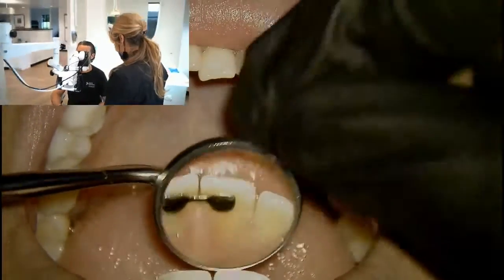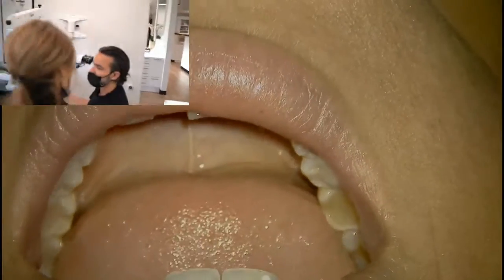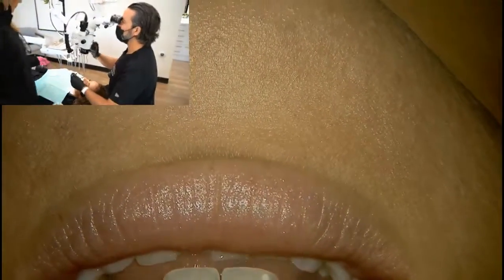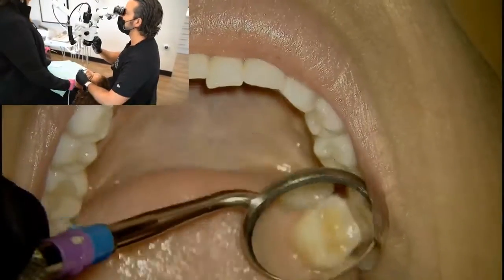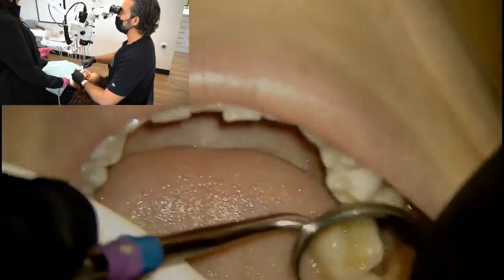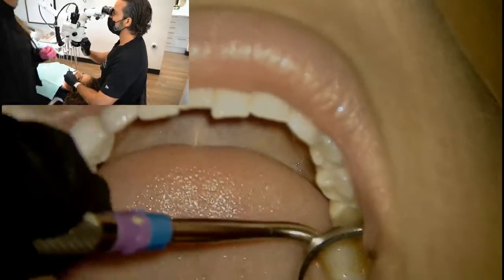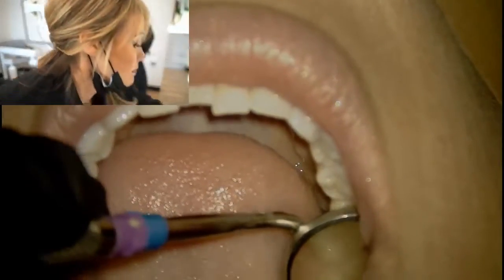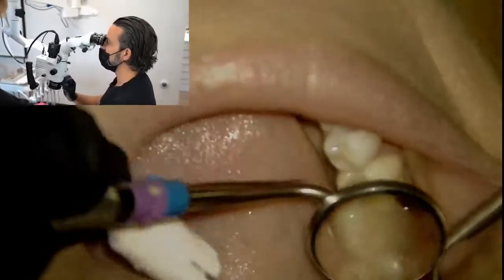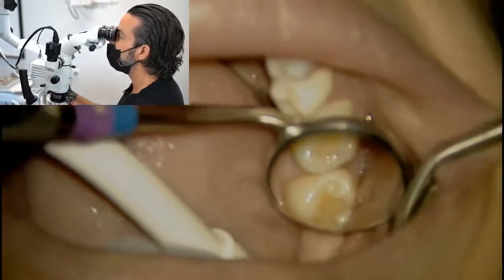All right, so everybody's a dentist here, I suppose, so doing an examination is nothing new, but maybe just working around the patient and in the mouth is unique to this. So I'm going to do a little bit of parfocaling, and like I said, do you want to give me something to retract back here? If you want to get another mirror to pull back a cheek for me, and then just suction. All right, so we're going to look at her second molar.